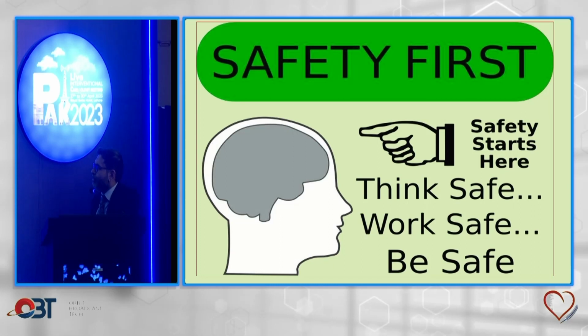So how do we optimize it in the cath lab? First thing, you need to be familiar with the radiation. When new nurses come in, even if they're not wearing lead, the physician is pressing on the paddle and they're still there. So they need to be made aware that there is radiation going on.